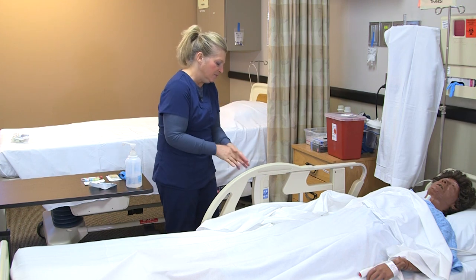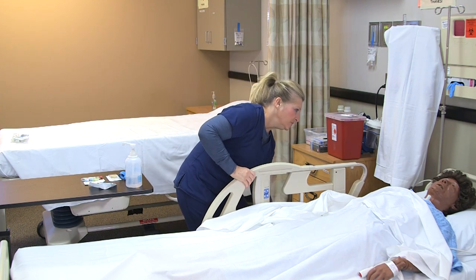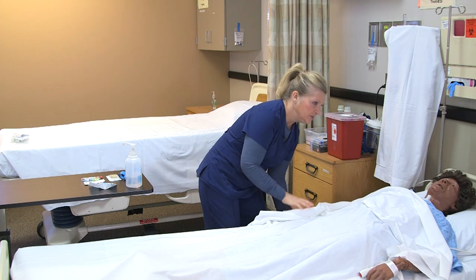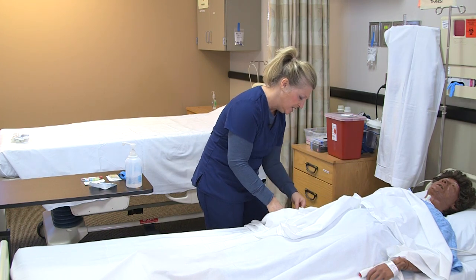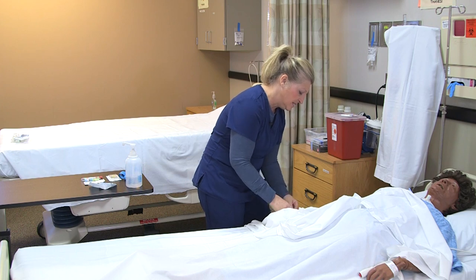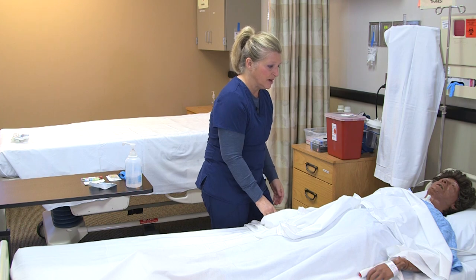I'm going to ask the patient to identify themselves. The patient has a wristband on, so I'll ask for their full name and date of birth. I'm also going to ask if they have any allergies, and then compare that information to my EMR.